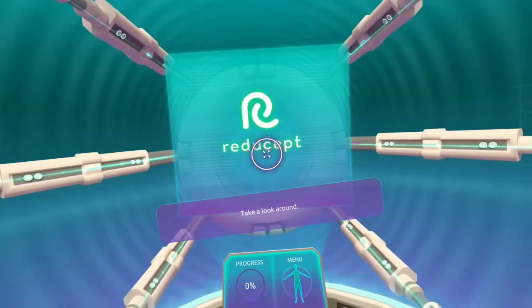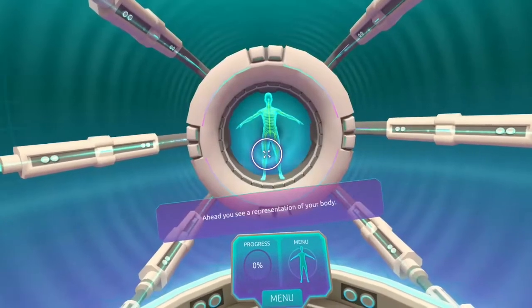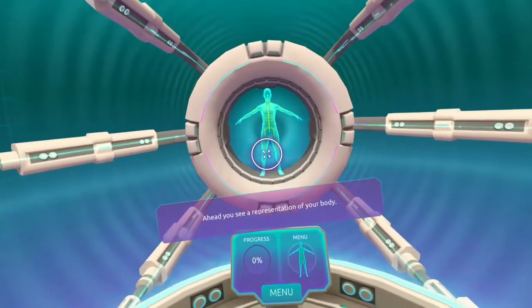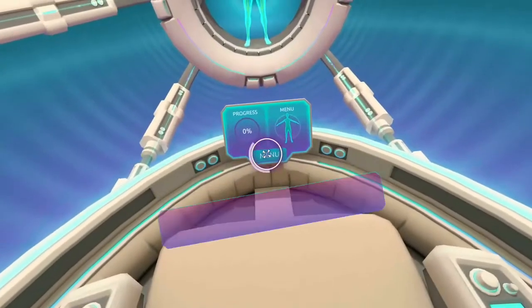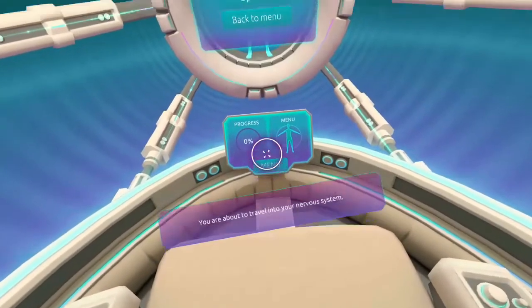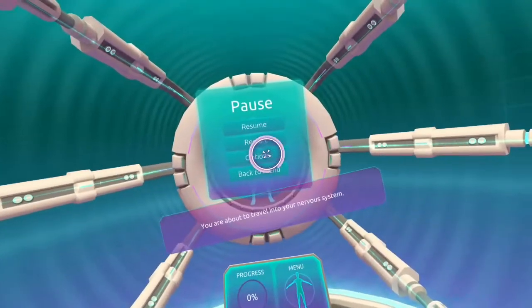Take a look around. Ahead, you see a representation of your body. You are about to travel into your nervous system.